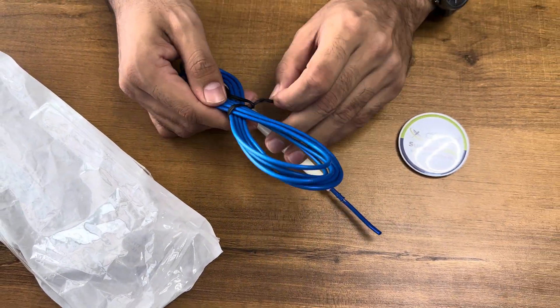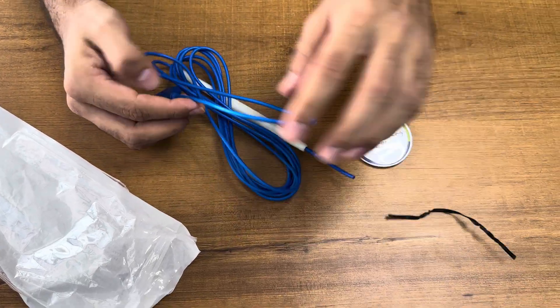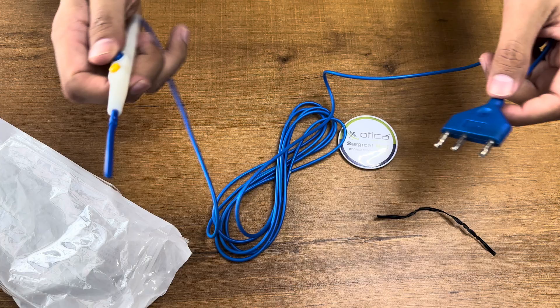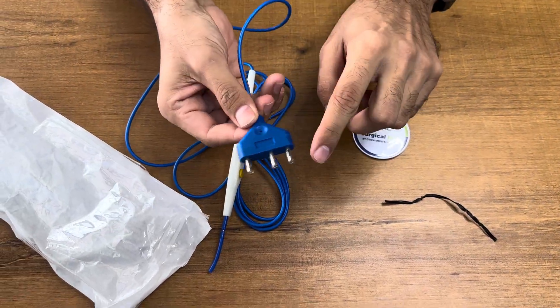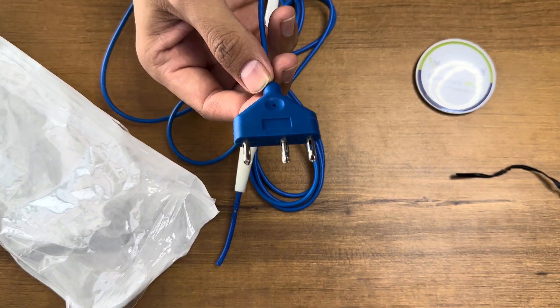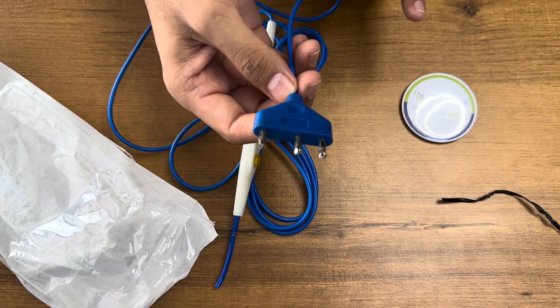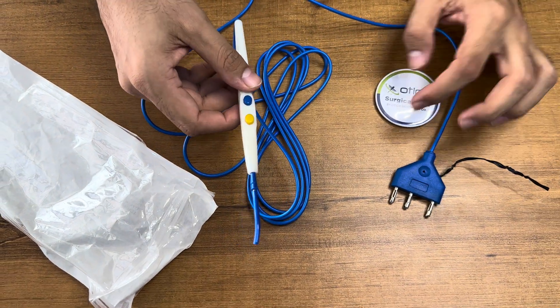This device pencil comes with a 3 meter cable so you can easily operate with your cautery machine. This is a very universal connector — 99.99% this cable is compatible with all kinds of cautery machines available in India or in the world.